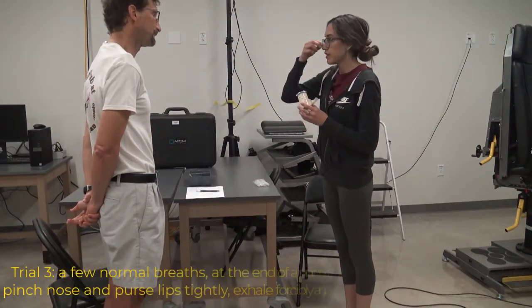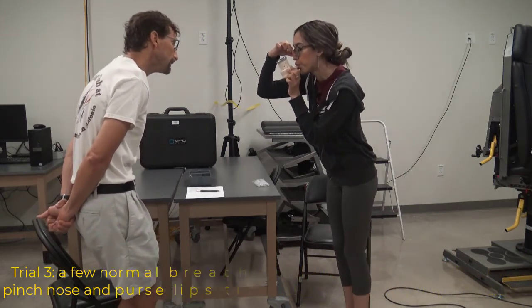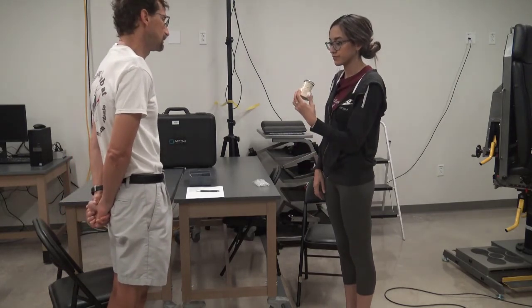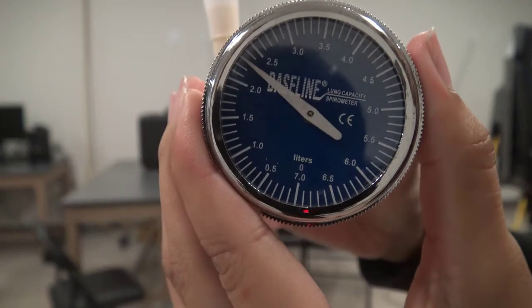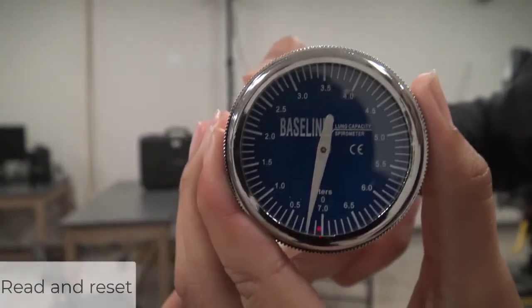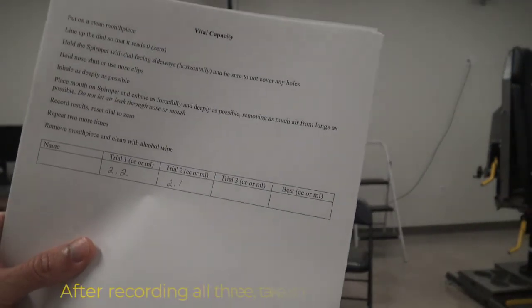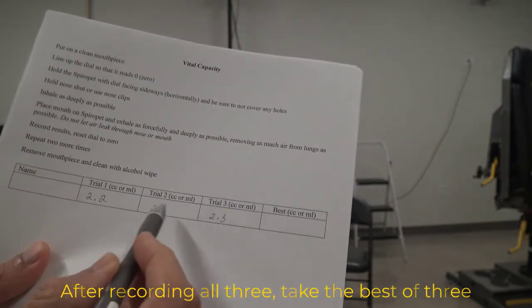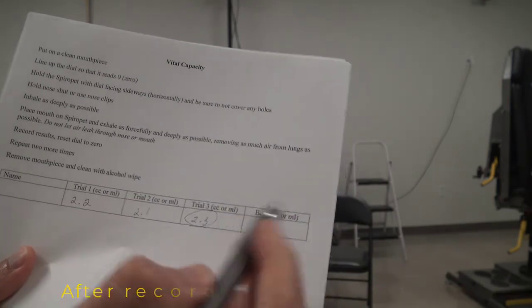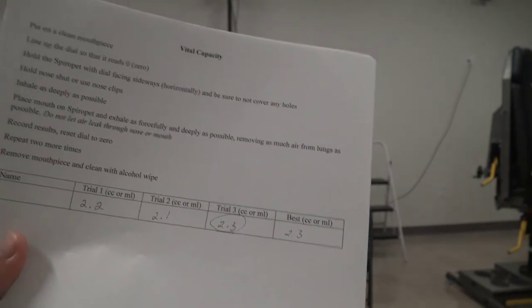And here's the third trial. So notice the technique. End of the last breath, breathe in as much as you can. Pinch nose, purse lips. Blow for 6 seconds. Read the dial. Looks like we have 2.3 on this last trial. And then reset it to 0 again. As we're performing the trials, we want to record the data. So we remember we had 2.2 and 2.1 liters for the first two. Now we have trial 3, which is 2.3. We take the best, not the average, but the best to indicate performance.